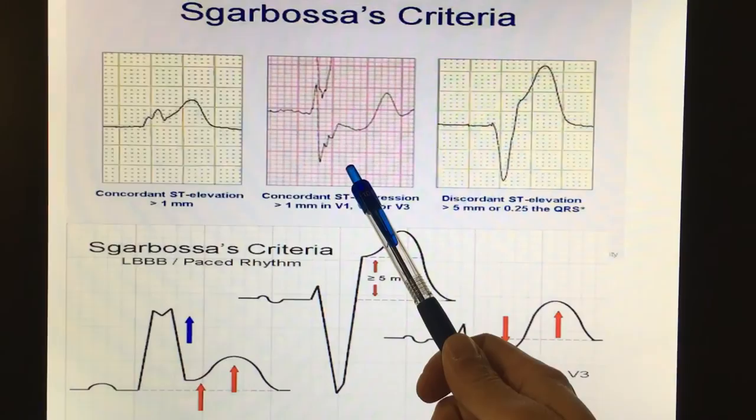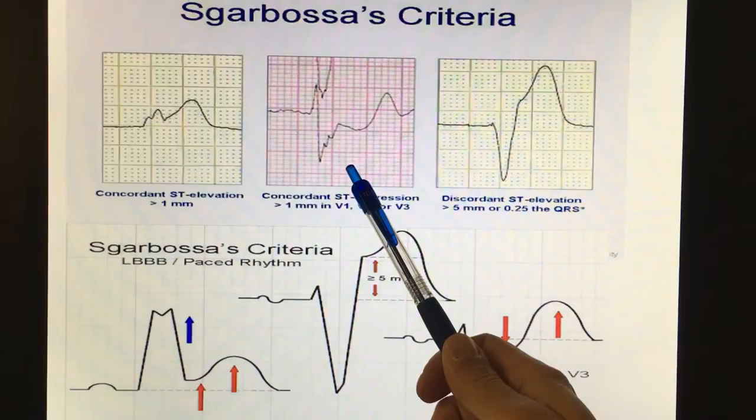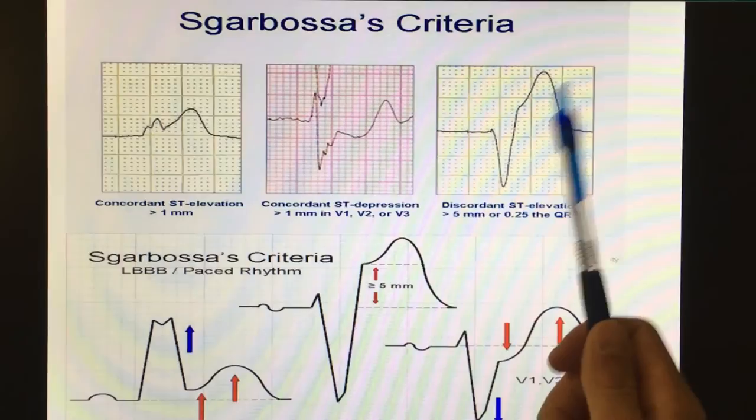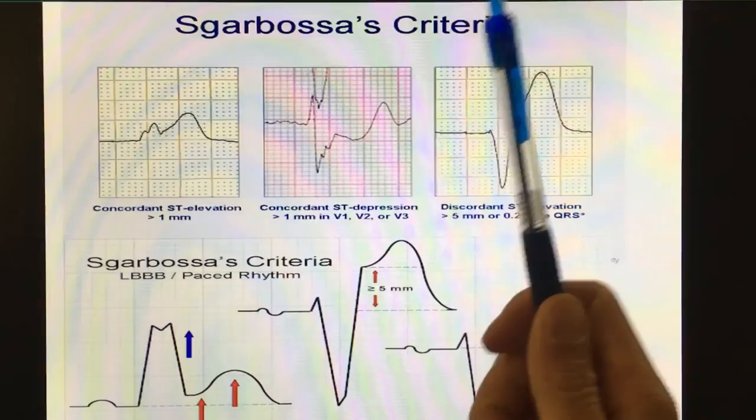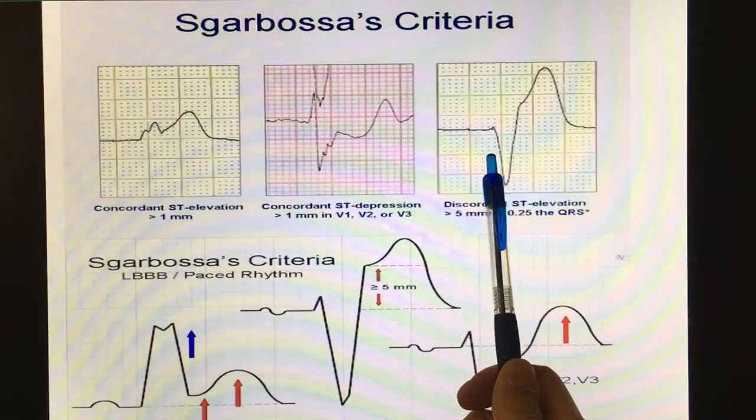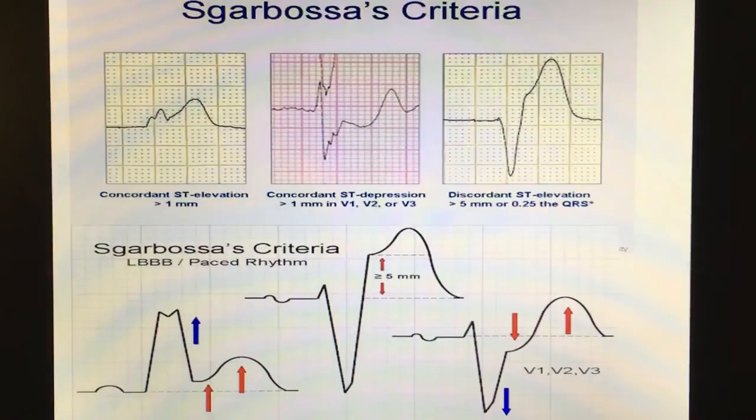The first criterion is concordance. The second is ST depression. The last one is big ST elevation, which you'll sometimes see in V1, V2, V3. It's important to remember Sgarbosa is not sensitive, but it is specific. Especially the first two are considered really specific. You can't call a STEMI with just the third, but those first two you can call a STEMI from the field when you see them on EKG.